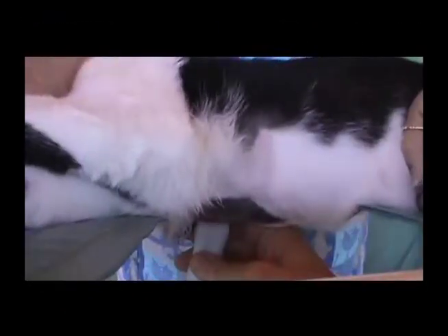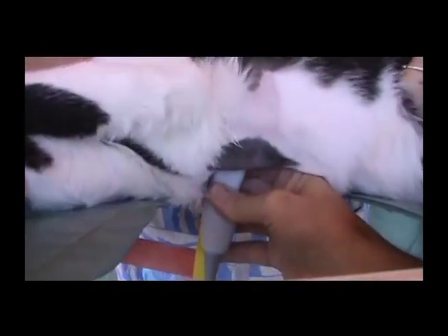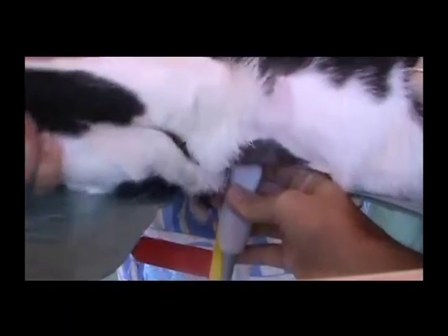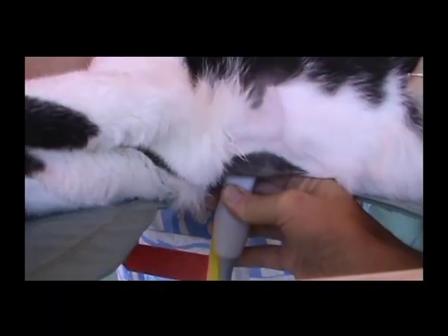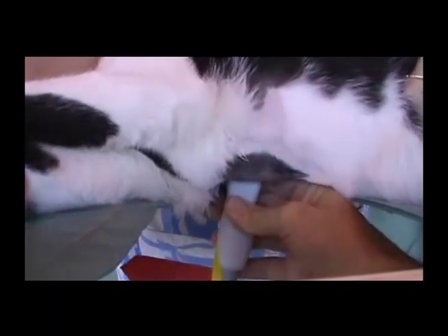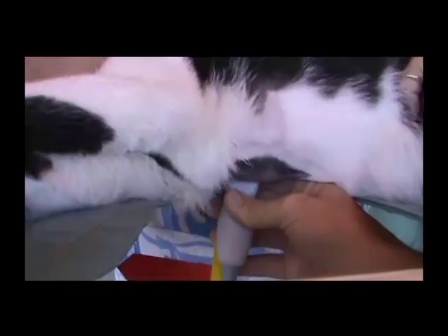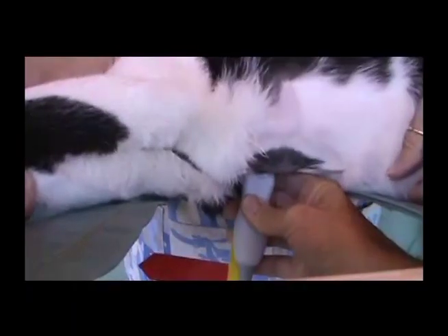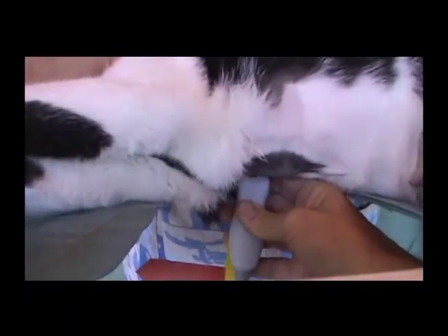Many ultrasound machines have an ECG lead attachment that allows an ECG to appear on the ultrasound screen. This allows M-mode or two-dimensional measurements to be coordinated with the ECG. In veterinary medicine, the ECG clips can cause patient discomfort and struggling movements, which interfere with the echocardiogram.